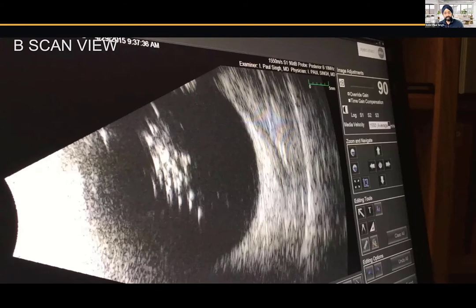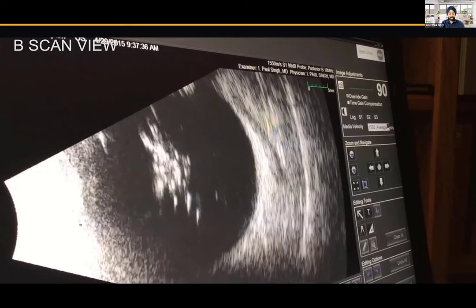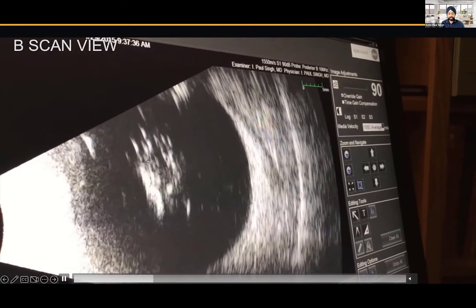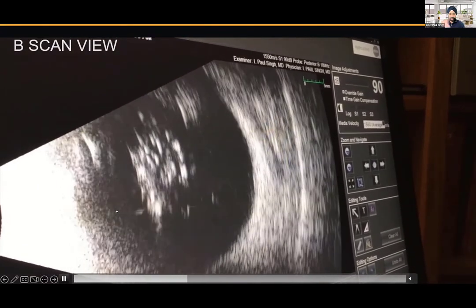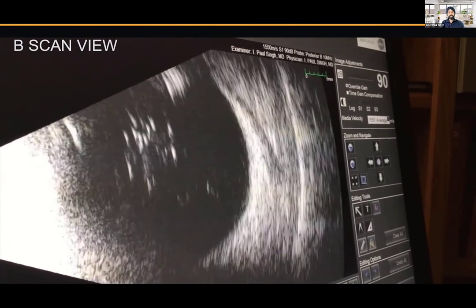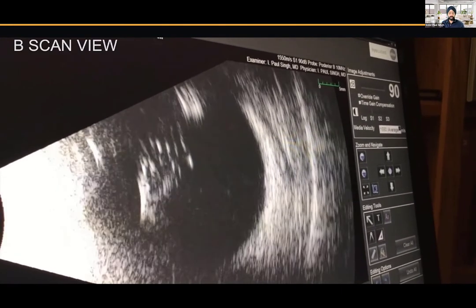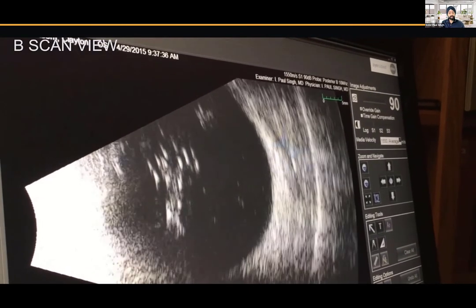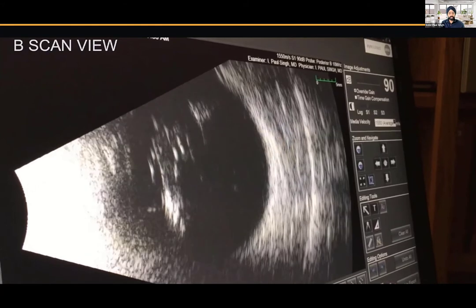And this is another one of my videos, very similar to what they've done here, showing that you see here very little movement of vitreous beyond this large opacity here. The white lines you see are just artifact from the sound of the clicking of the buttons. But there's very little movement of the posterior hyaloid, or even a millimeter surrounding that opacity. So these middle opacities are really, I think, primed to at least help address some of the issues we face.